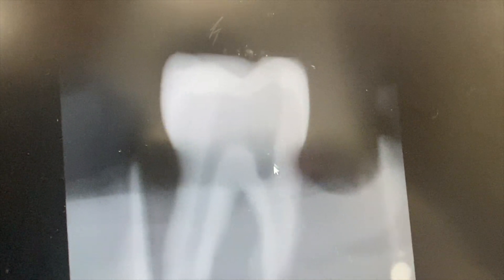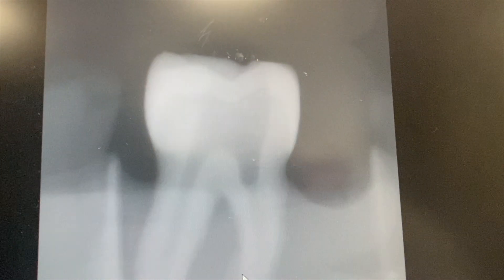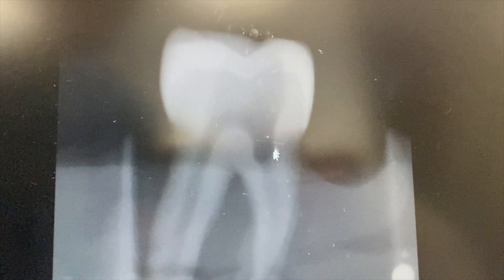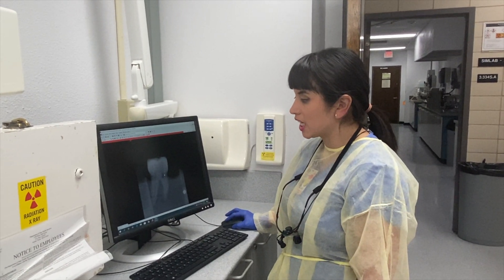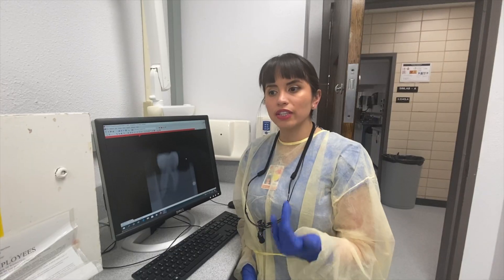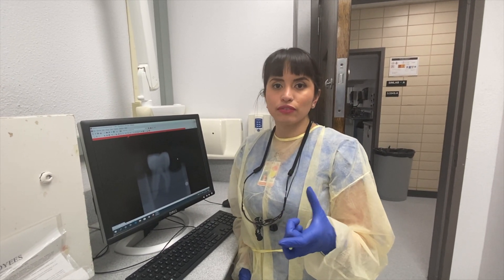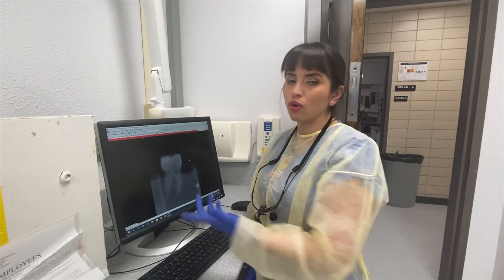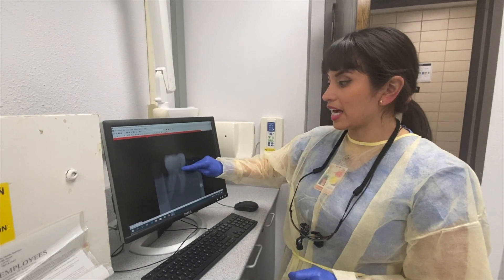When we're using files, we want to try to get rid of this little ledge that tends to cause essentially a second bend. If we remove this angle, then with straight-line access there is only one bend in the tooth. So would you go back and take that out, or leave it for the REB? I would remove it. It's as simple as coming in here and just pecking at the edge again with your orifice opener or gates glidden — I would use the orifice opener. Your K3 purple file is only about 14 millimeters long, and typically a molar is about 18 to 20 millimeters, so it's really great for just getting that little ledge and opening that up.